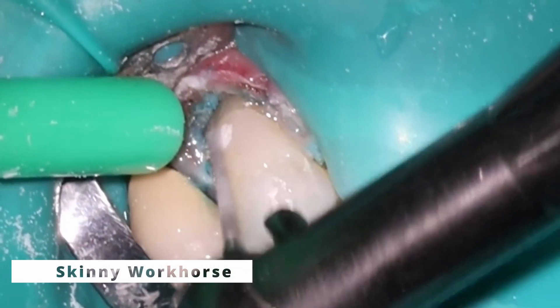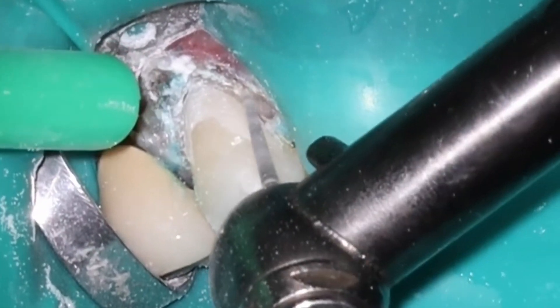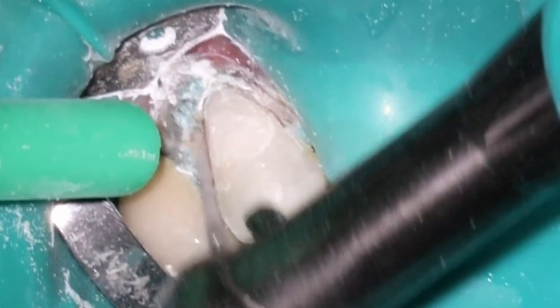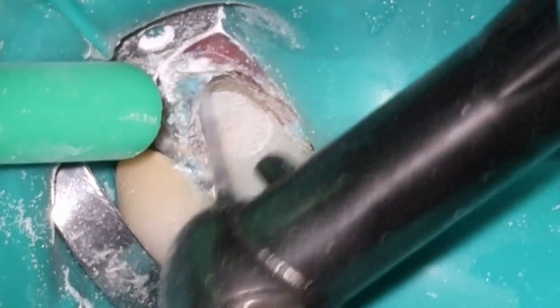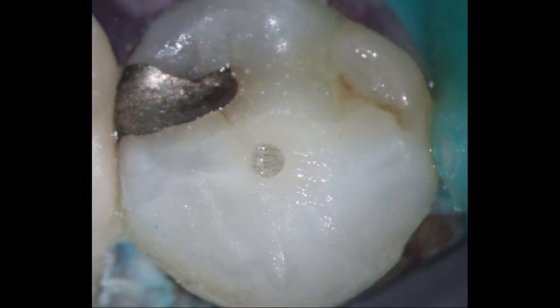The Class 5 looks pretty good — no leakage, no issues with the gingiva. One thing that helps when you have the clamp on the gingiva itself is it actually helps create pressure hemostasis as well. I'm going to go ahead and polish this up using the skinny workhorse. I probably could have polished it here, but I wasn't sure whether or not the dentist was going to do a crown on top, so I left it a little bit rough. Looking back on it, I probably should have used a polisher just in case this was going to be the final restoration. Pretty traditional Class 5 — the gum tissue should heal up nicely. There's the occlusal and there's the amalgam we talked about.